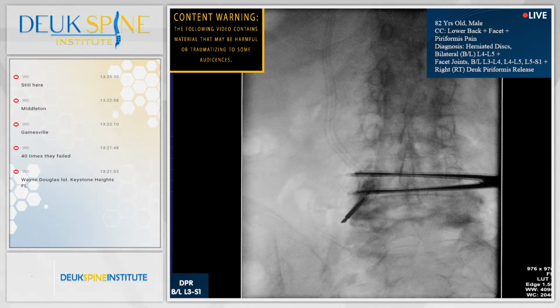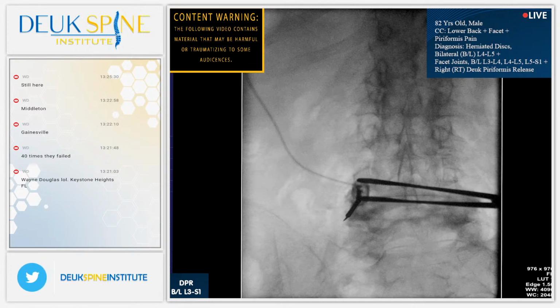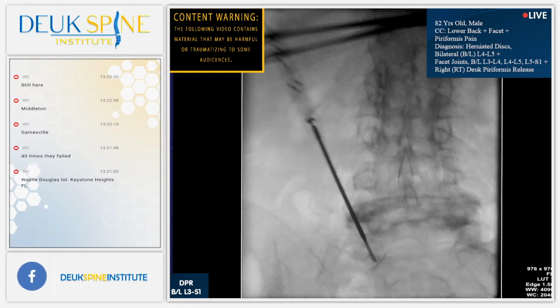All right, let's see. I think that's L5 right there, right? And then we have to do S1, which is below. We've got 1 minute, Dr. Deuk. And then we do the piriformis. Yep. All right, we're going to end the live stream in 1 minute. If you have another question, ask it. But we're done with the facets. We're going to move on to the piriformis muscle next.